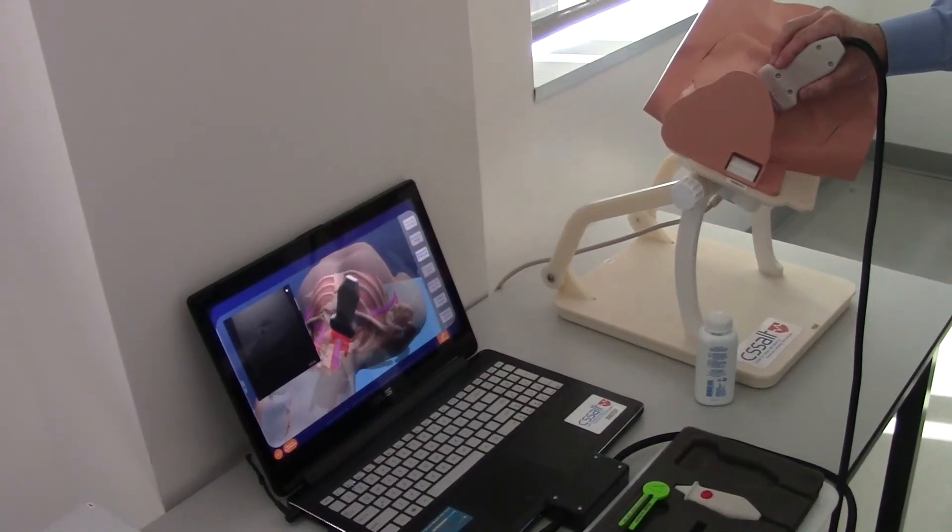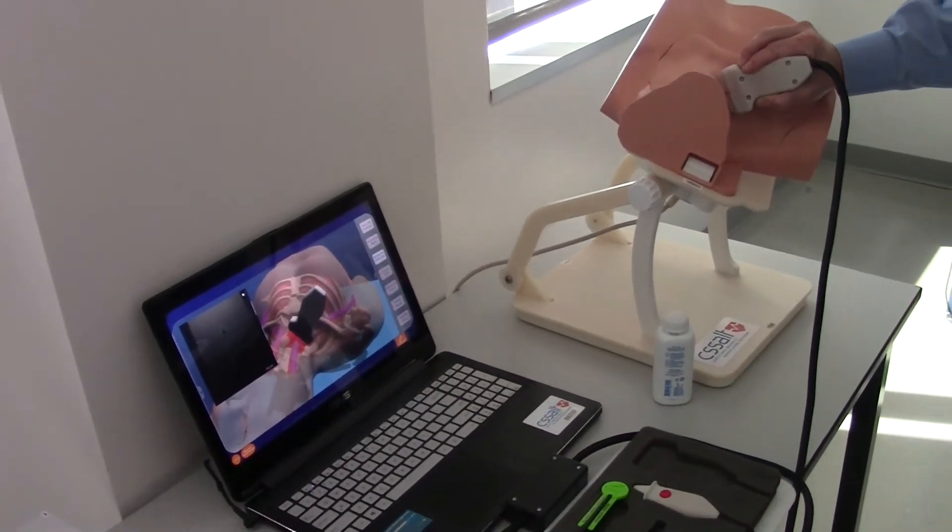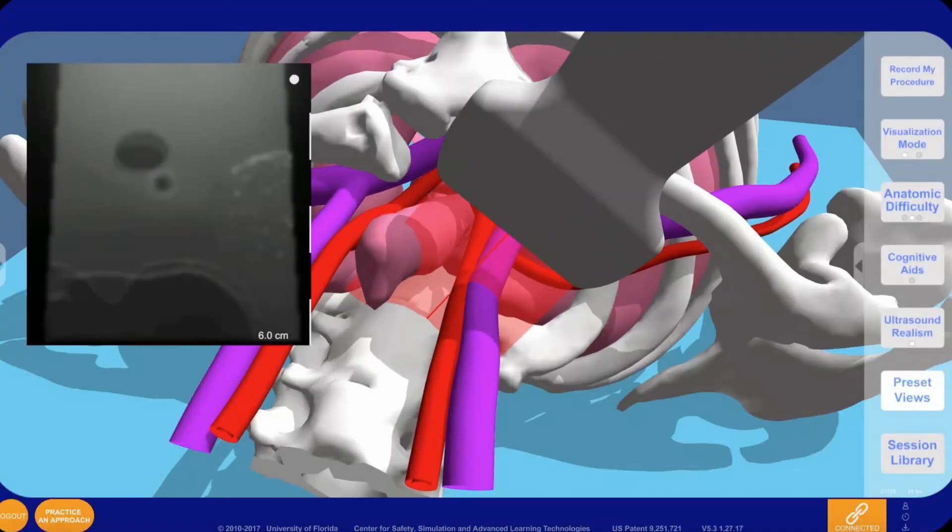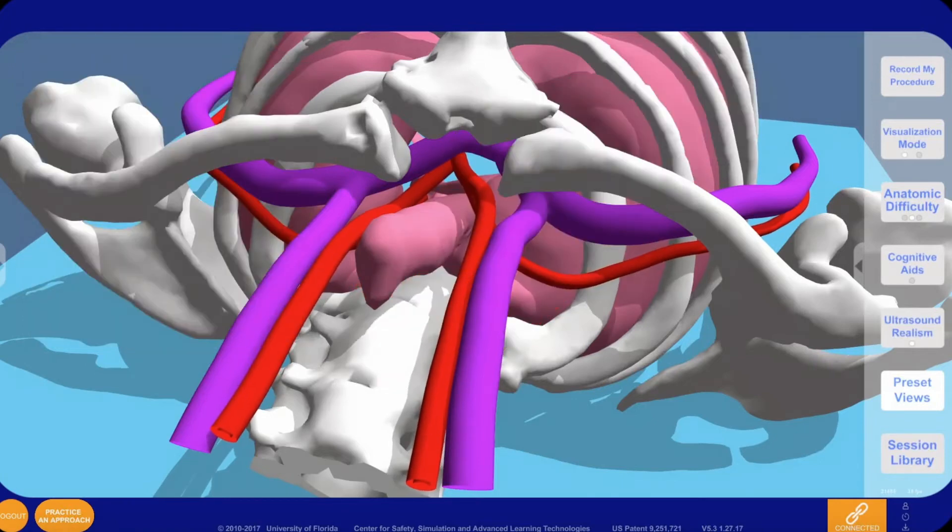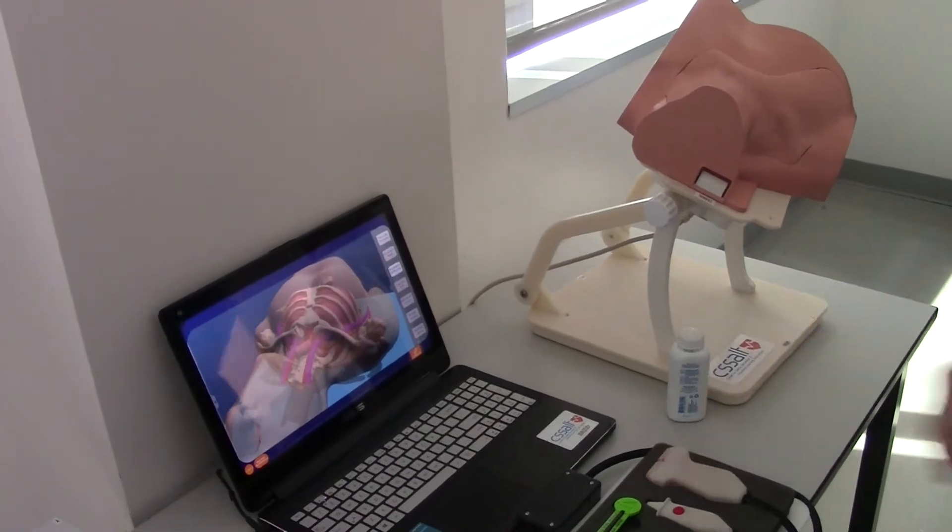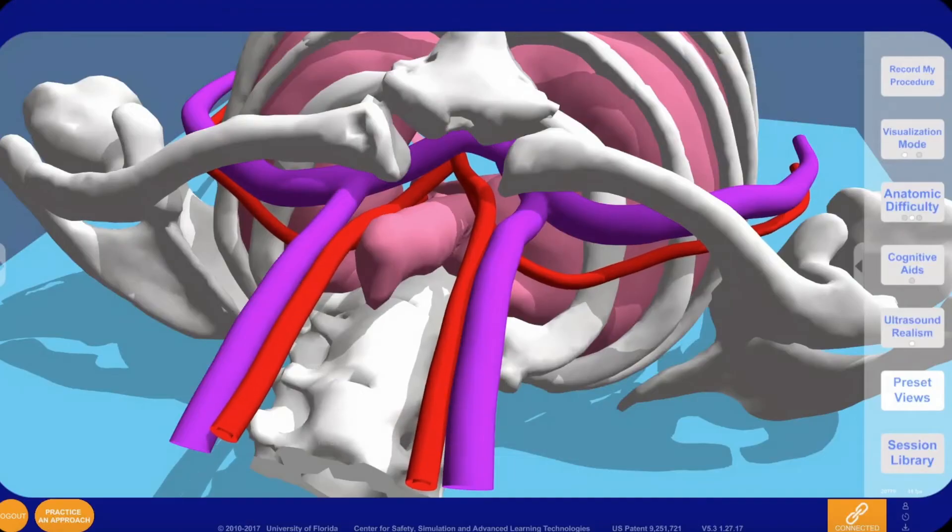Virtual veins can be compressed by the ultrasound probe and by the needle. Users can learn to be mindful that veins can fully compress flat if too much pressure is applied. This encourages backwalling, which the simulator will detect. Users can also use ultrasound probe pressure to distinguish the vein from the artery, which does not compress and pulsates.